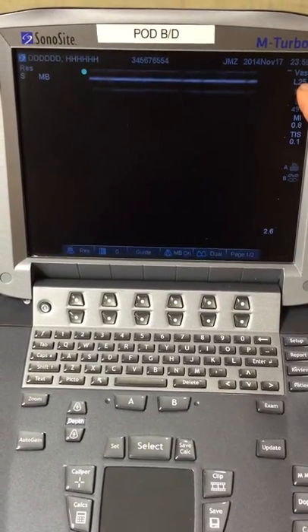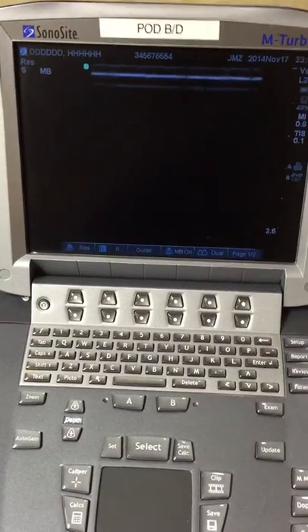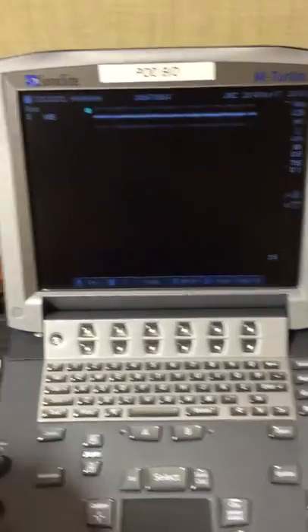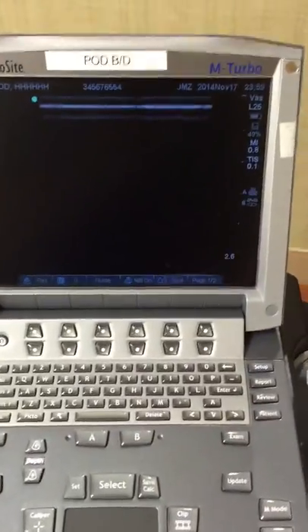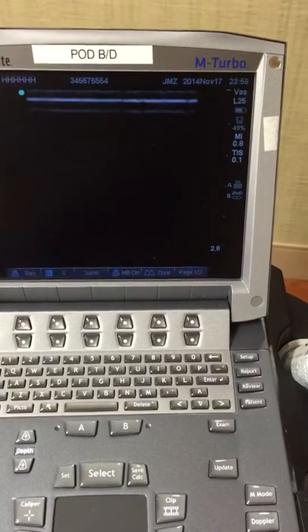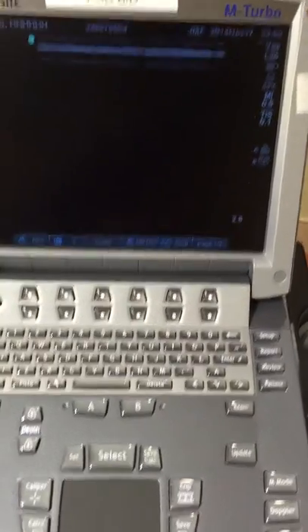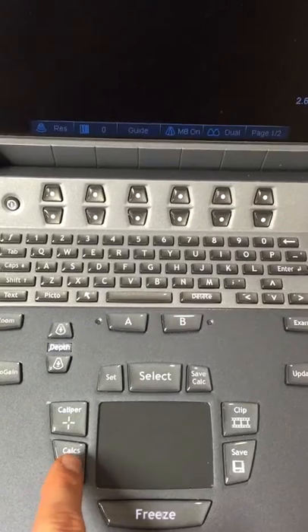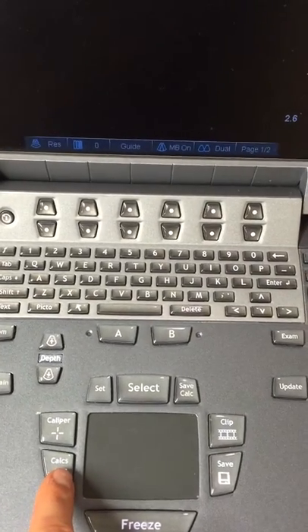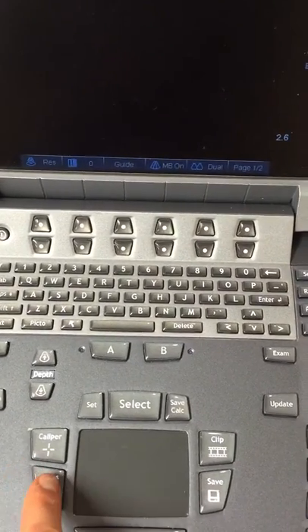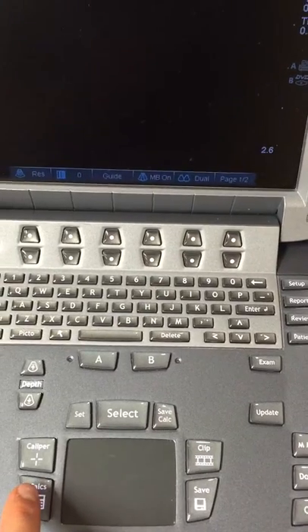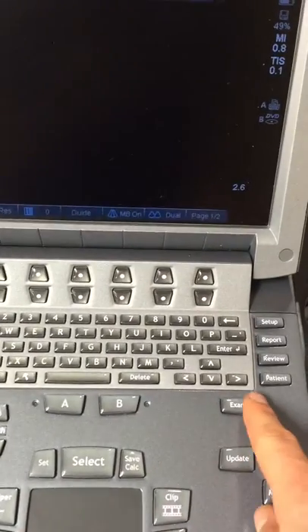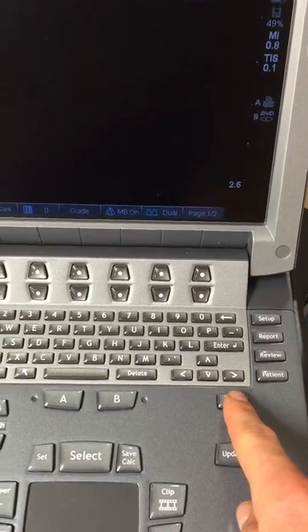This is really important, especially if you're doing an OB scan. You have it on the phased array probe here, and then you want to check the fetal heart rate. Well, all the presets within the probe for the calc button here, you have to be in the right section. So if you're doing abdominal exam, and you really want to do OB, you need to make sure you switch the exam to OB to get those settings.